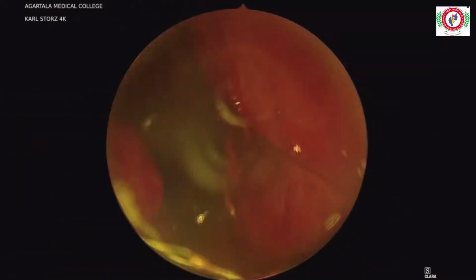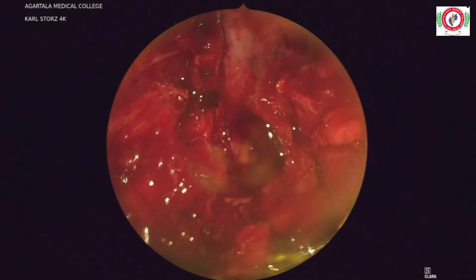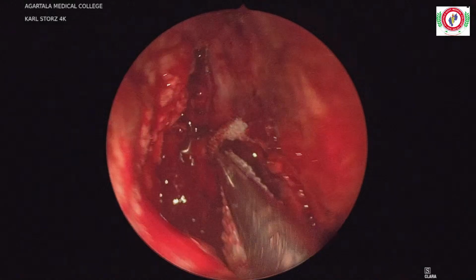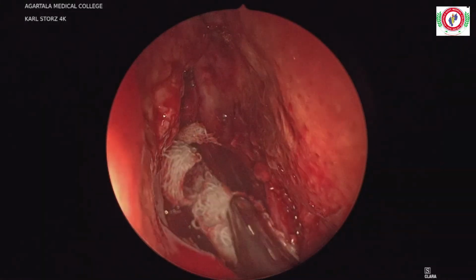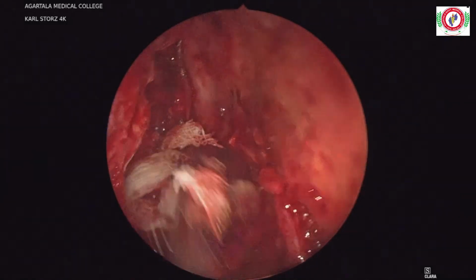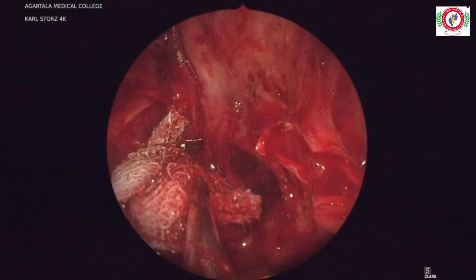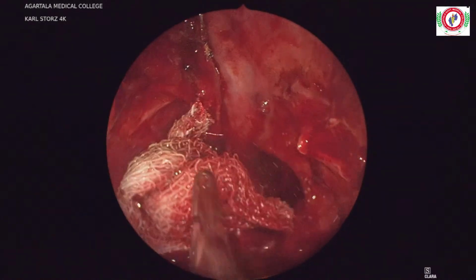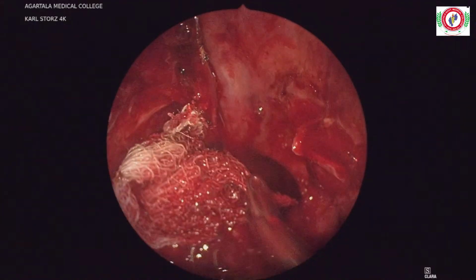Meanwhile, you can discuss a few approaches for such tumors, the endoscopic approaches. Give me this pack, big pack. If your tumor is going in the ITF, do you ever go with the pre-lacrimal approach?